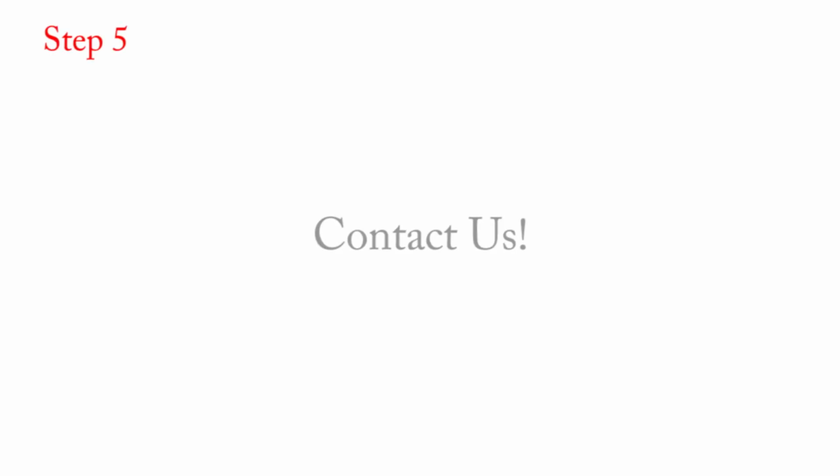Step 5. Contact us. After the evaluation is complete and your results have been recorded, please reach out to us to discuss the data, pose any questions that you have, and talk about the next steps. Now that we've gone over steps for implementing orientation media, we're going to move on to some frequently asked questions and answers.